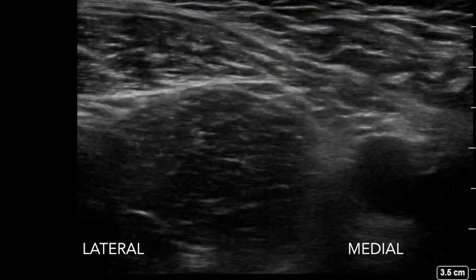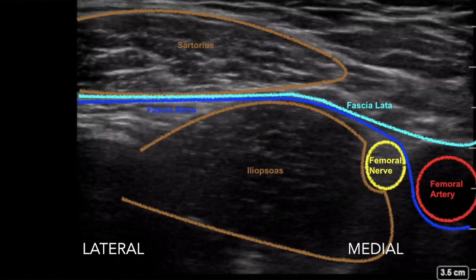The first approach is the infrainguinal approach. Here you can see two muscles: the sartorius muscle laterally and the iliopsoas muscle. The femoral nerve is beneath the fascia iliaca and the femoral artery beneath the fascia lata.